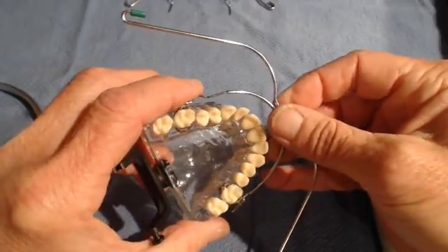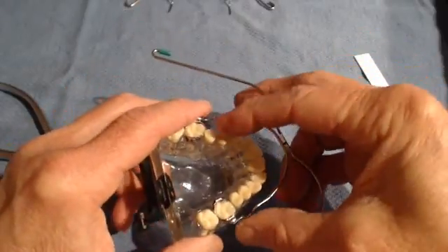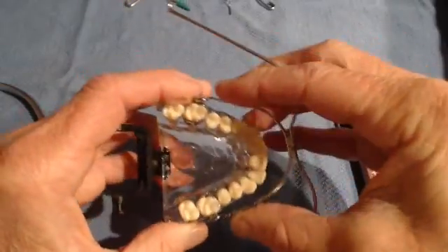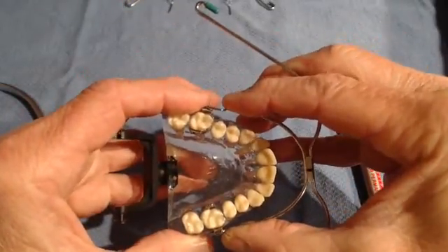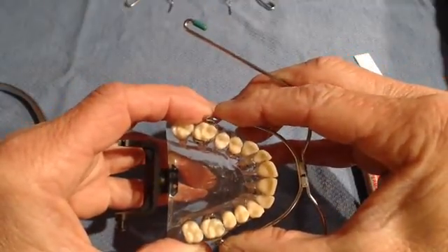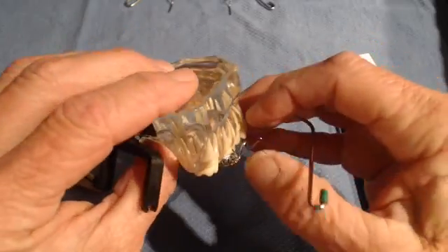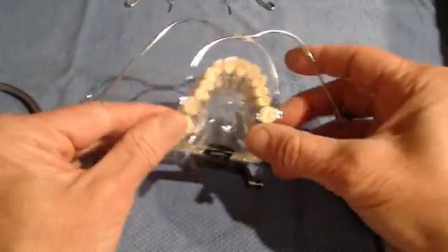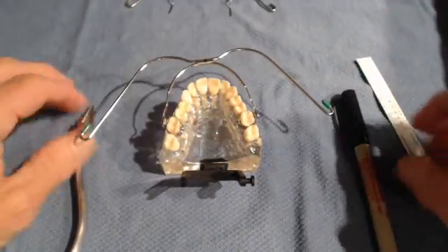One side is going to be easy to insert and the other side may have some slight resistance. You will find out which side is better — in this example, the patient's right side is far easier and smoother to insert and remove. That is the side you'll have the patient insert last; have them insert the harder side first.